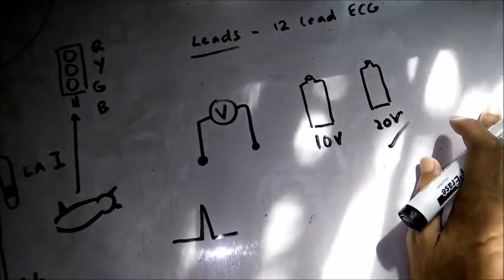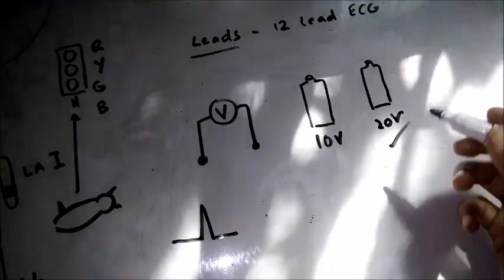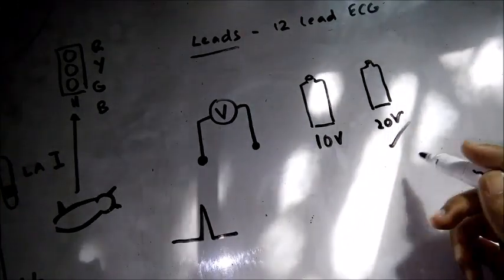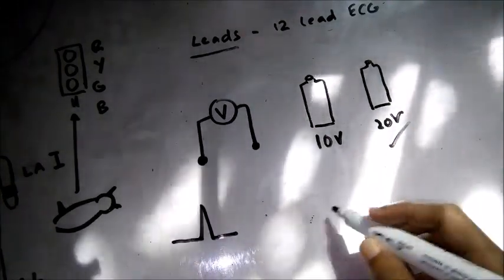Now in electrophysiological systems, potential is a very important thing, right? What is potential?